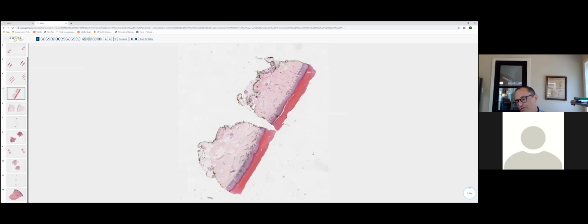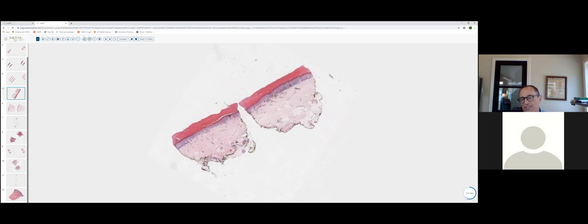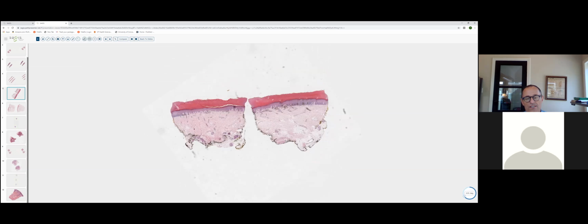Okay, we'll go ahead and move on to 5 and 6. And I kind of wanted to discuss these two together. Sometimes in these sessions, we're going to discuss common things because as you're going out into dermatology and looking at your own slides, you're going to need to be familiar with the histologic findings of common things. And I think a lot of times when we do dermpath conferences, we kind of drill down on the esoterics. So I think it's a good idea sometimes to go back and cover common things.